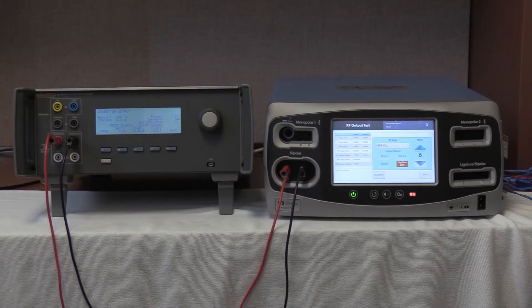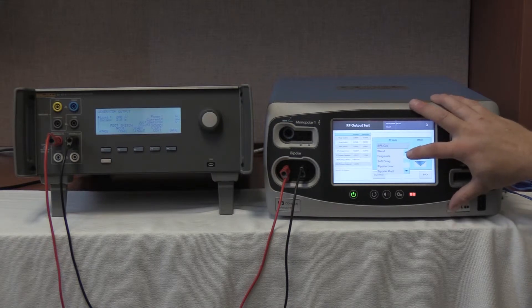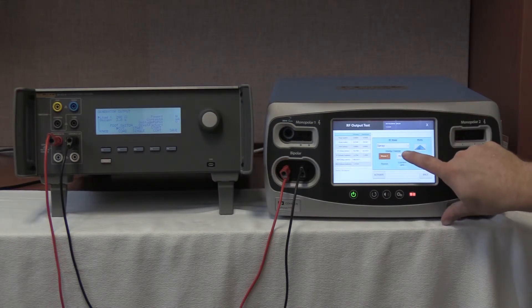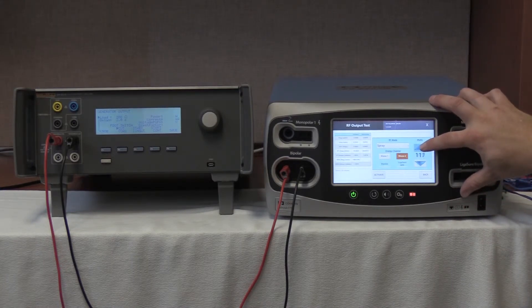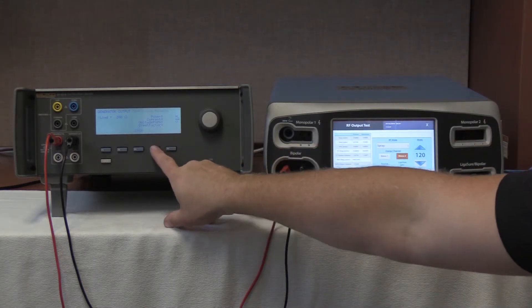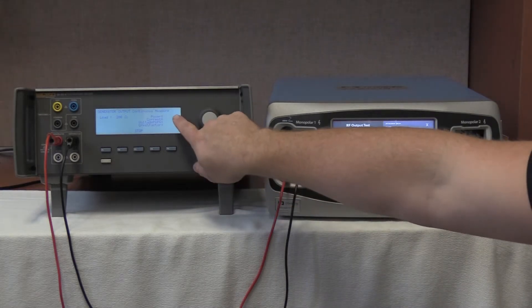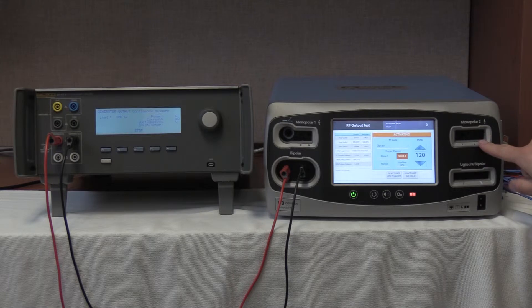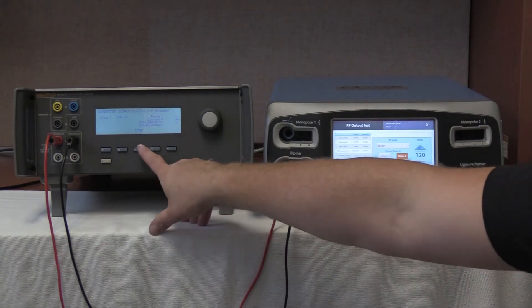We are now going to test monopolar 2 COAG spray. Select the RF mode and go up to spray, monopolar 2, 120 watts. Our reading should be between 0 and 50 mA. Start continuous on the QES-3, activate at the FT10. We have no reading, which is fine, because we should be sending energy out of this port but we are measuring out of the bipolar port. Deactivate, no hold on the FT10. Stop on the QES-3.